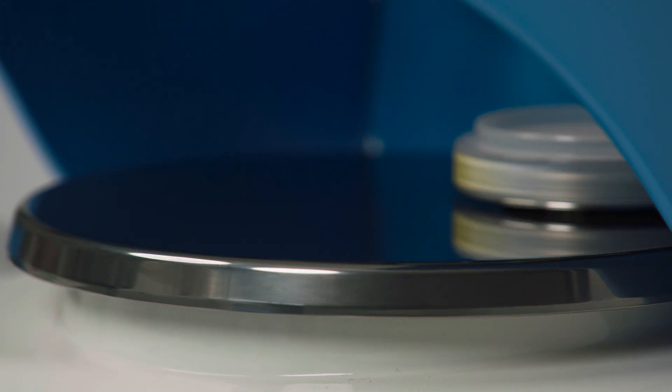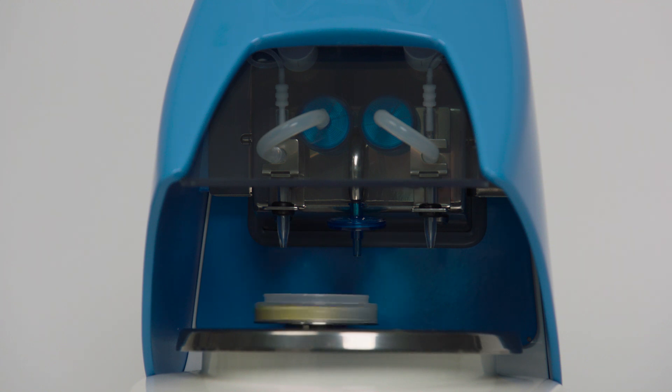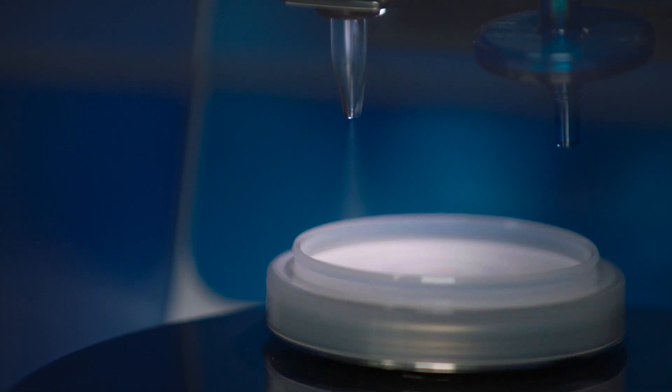In an automated sequence of steps, the autospray station sprays the right amount of both reagents, one after the other, evenly across the rotating and moving membrane filter.